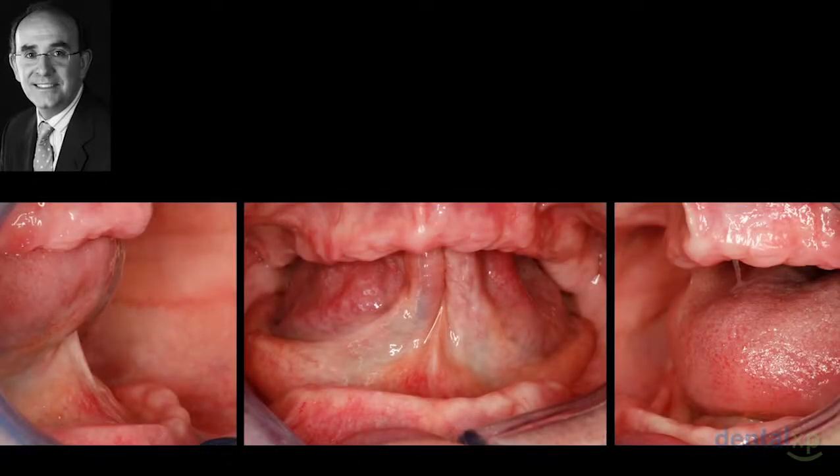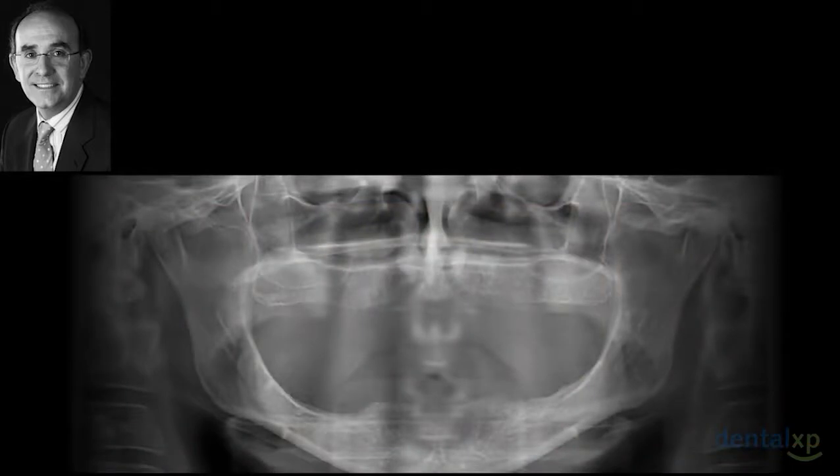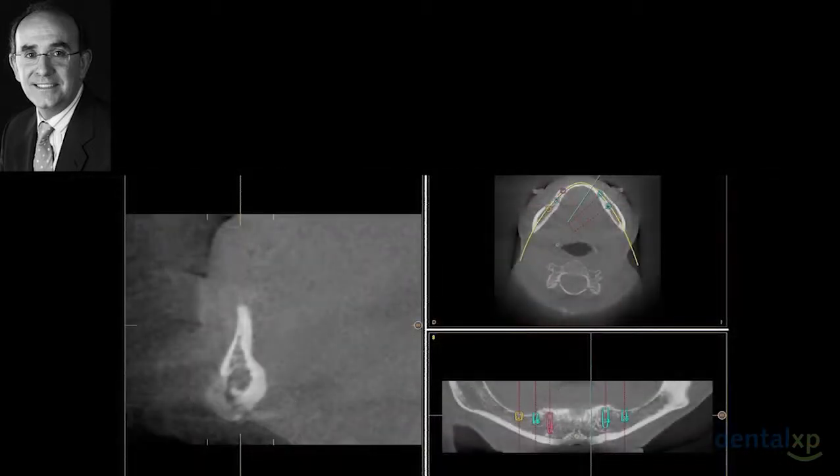Let me now present one severe resorption. The patient lost all the teeth, but also lost the bone. What is our approach in these cases? Of course, we analyze the residual crest. In this particular area, the patient has a really narrow crest. What is possible to do in these cases?